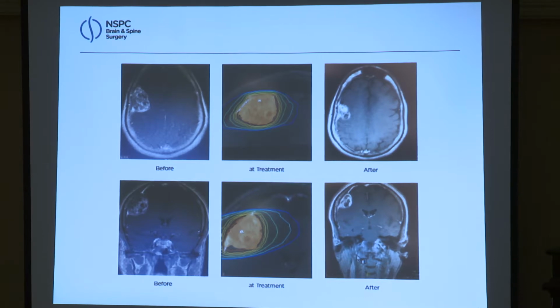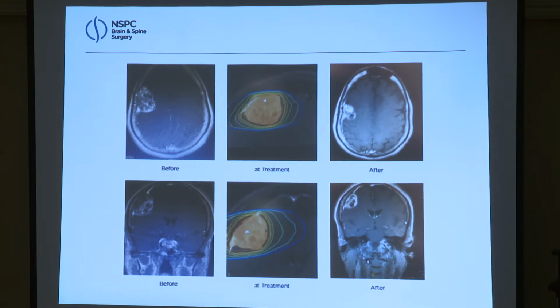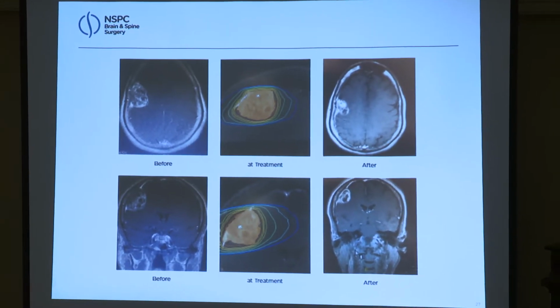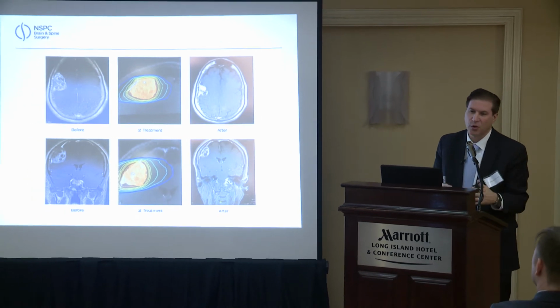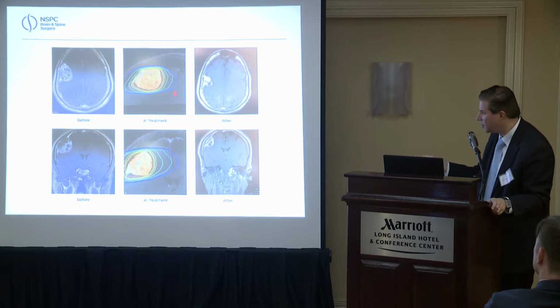And we said, okay, well, most people probably take it out. Radiosurgery is an option. But I suggested let's just take it out. She said, let's do radiosurgery, because she had done her research. So we said, okay, because it was a bit bigger, we did a Novalis treatment over 5 sessions. One of the ways of dealing with things that are bigger or near sensitive areas is to either give a lower dose or fractionate it, like give it over 5 sessions, or even stage it. You can treat part of the tumor today, part of it 6 months from now. So we did a Novalis for her.